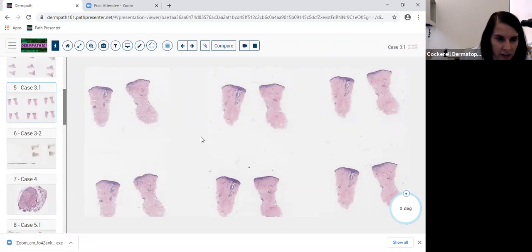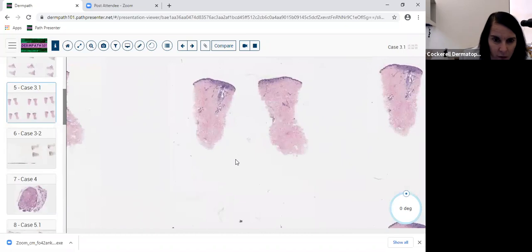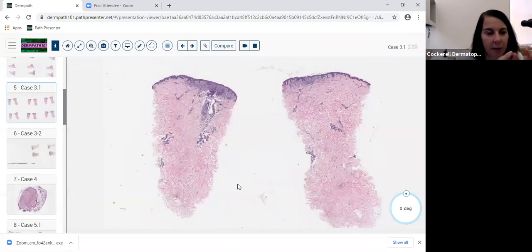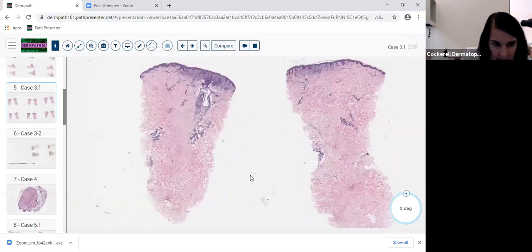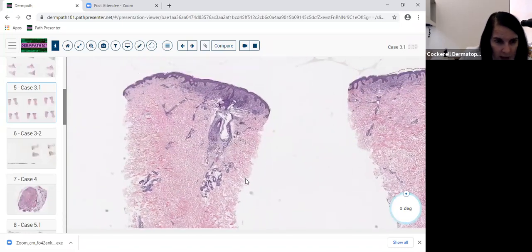I really love these punches. That's probably why they end up in these shows, because we're getting an absolutely gorgeous biopsy. Someone suspected an inflammatory dermatitis. They suspected a macular papular rash. It was somewhat pigmented. There were several of these lesions on the trunk and extremities. I actually saw the clinical photo of this. It was actually quite helpful.